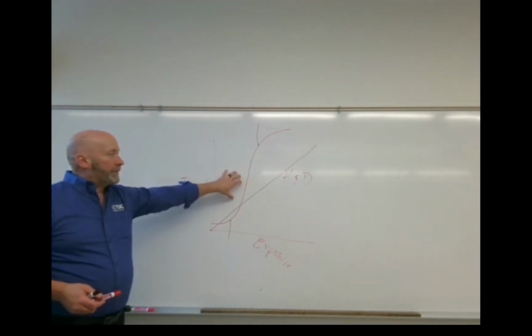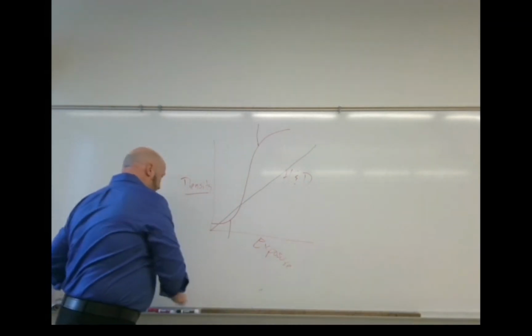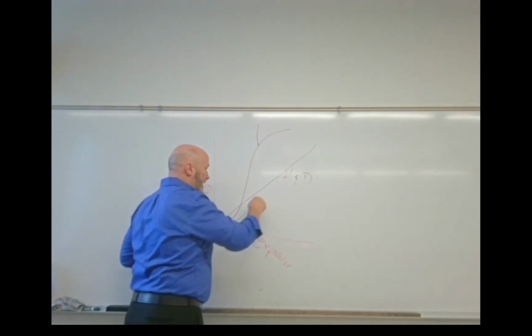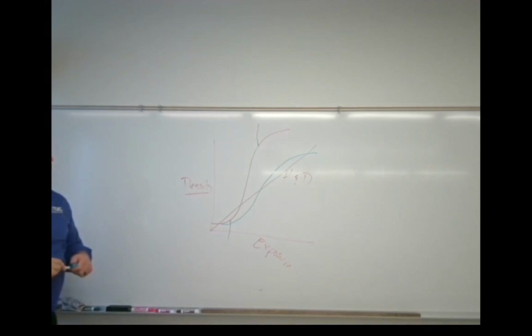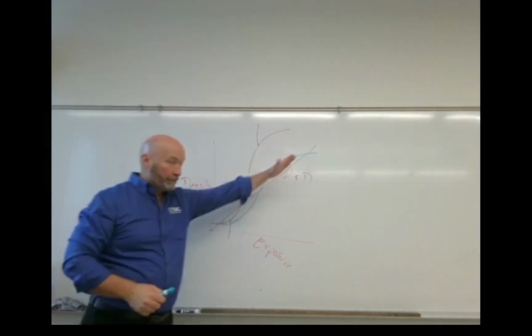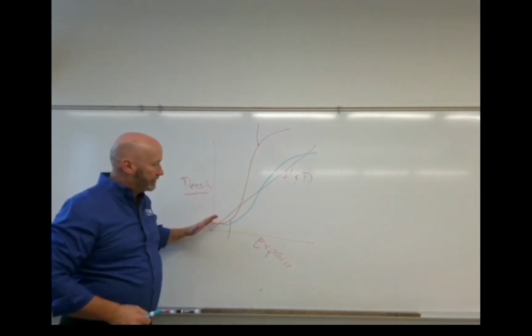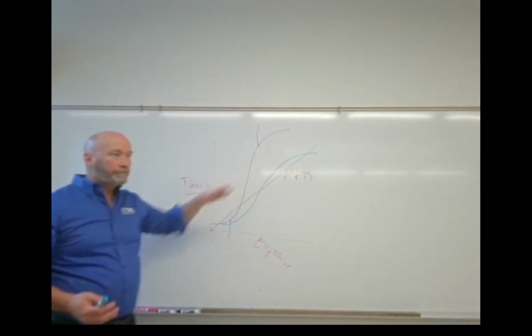So our 400 speed systems were kind of like that. Our slower speed systems, our 200 speed systems, drug that density out over a broader area. Okay, so where you're looking at the H&D curve, first off, your exposure to your image receptor on a digital image receptor looks like that. Okay, that's just your exposure.